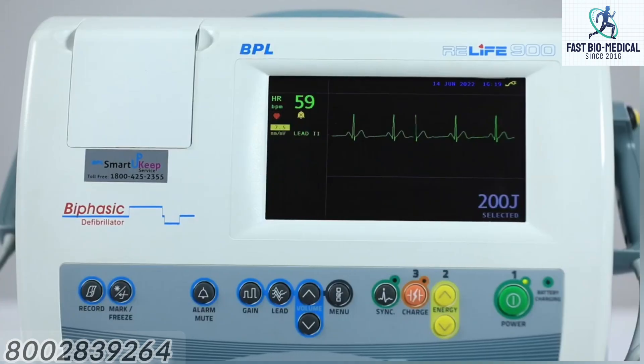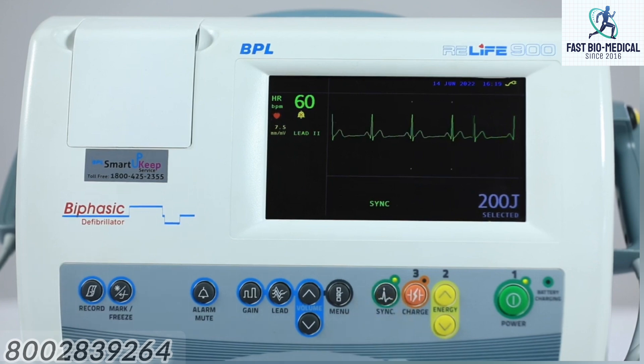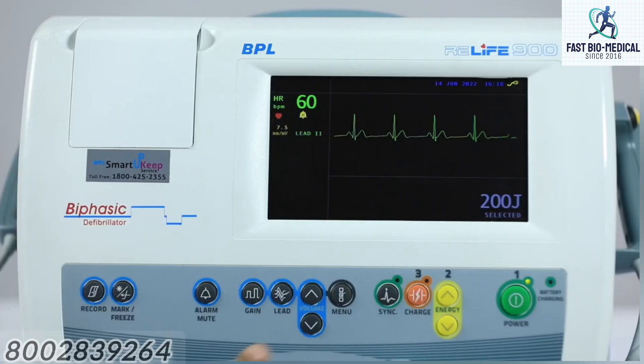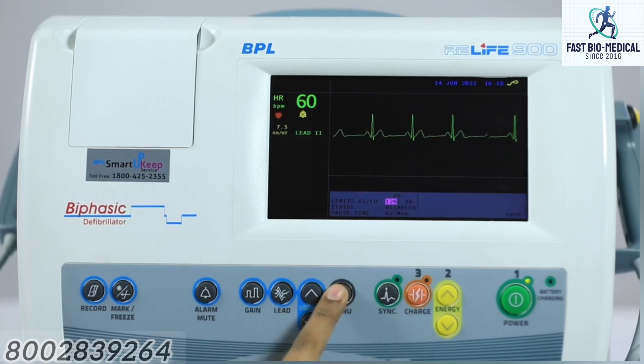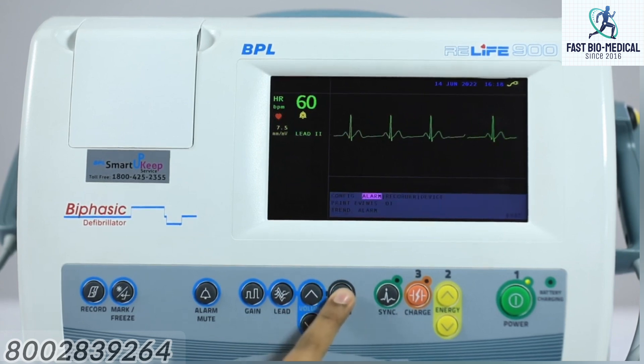Sync button: the LED located in this key is illuminated in synchronized mode and a sync message is displayed on the screen. The LED blinks during every QRS detection. Menu button: displays a menu on the main screen. Volume up or down keys are used for navigation, and the menu key is used for selecting any of the parameters displayed on the menu.